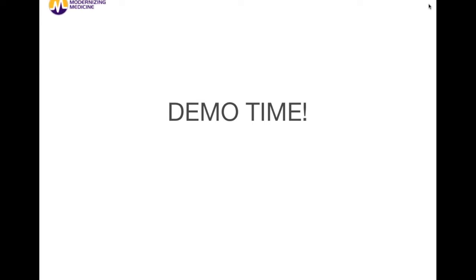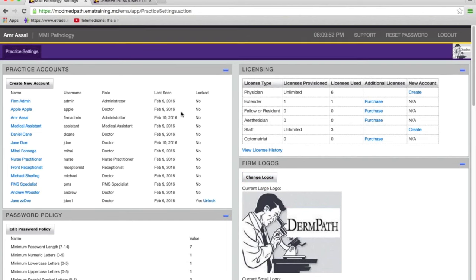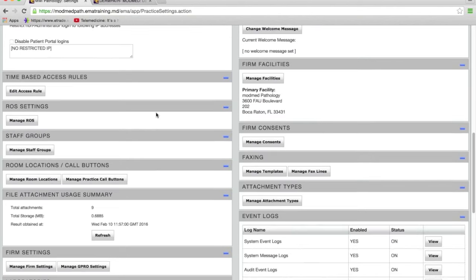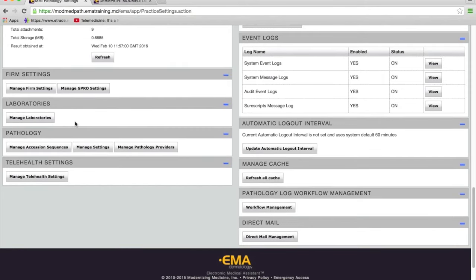There is a setup component in the module. I'm not going to go through the whole thing today because I want to focus on the workflow and how the integration with EMA is beneficial. I'll just cover one piece of the settings. In the firm admin account of EMA, under practice settings, there's a section for the pathology module.